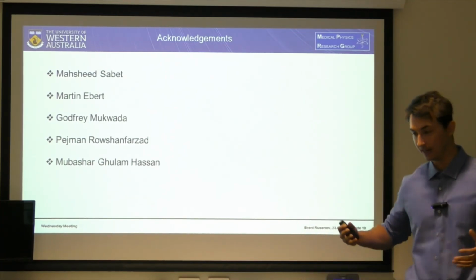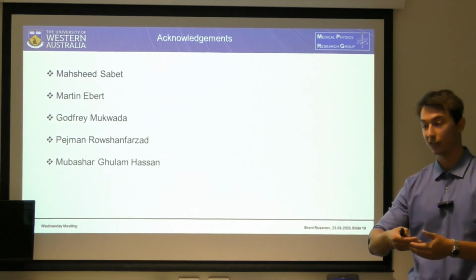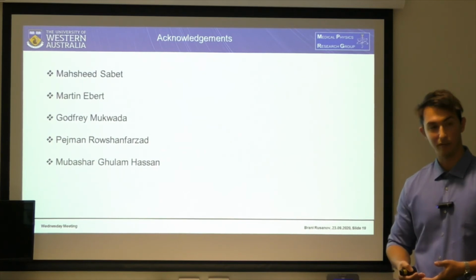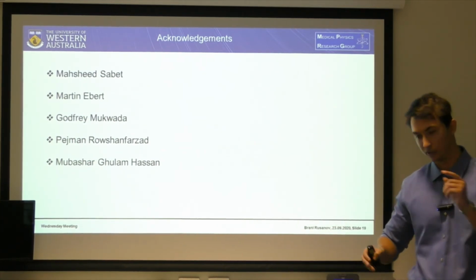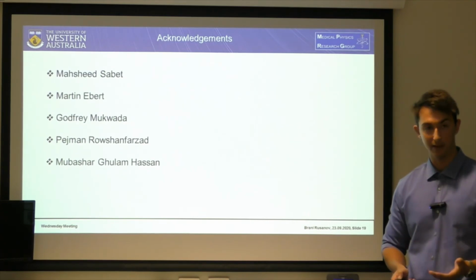They've actually integrated it into their workstations, and they actively use the neural network to estimate the intensity deviations and then correct on the fly. So it is possible, but it would require a lot of effort to get it working so you just click a button and it outputs the reconstructed CBCT. There's a lot of work in that respect, but it can be done.